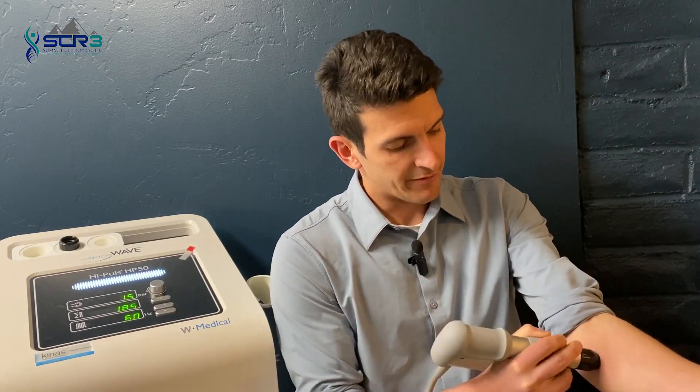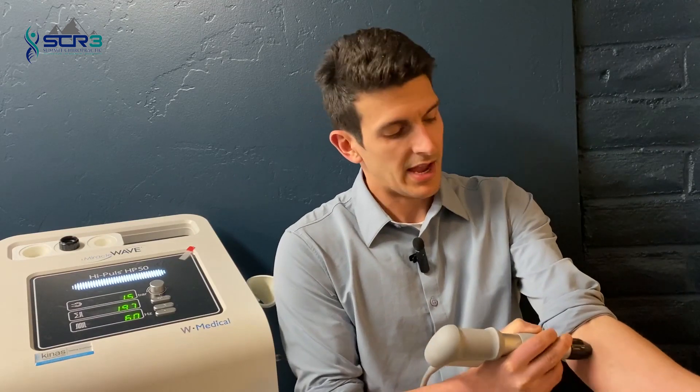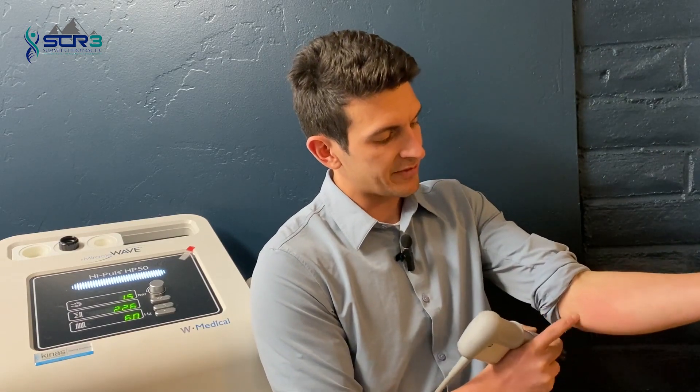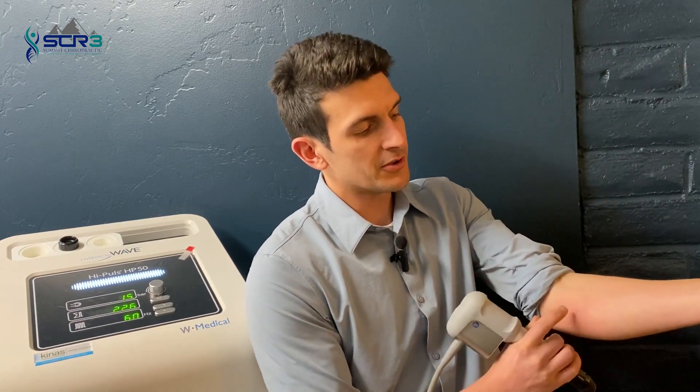It's a very simple, very affordable, cost-effective treatment for a host of tendinopathies. What we'll typically do is perform a treatment at the local area of discomfort — so where the common flexor tendon is — and also to the musculature that contracts and pulls on that tendon, for something like medial elbow pain.